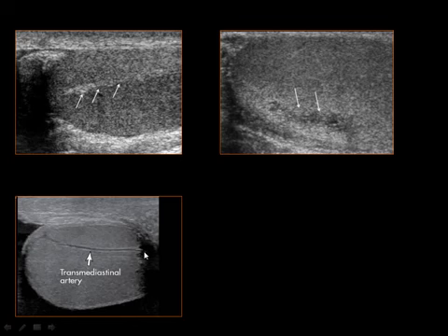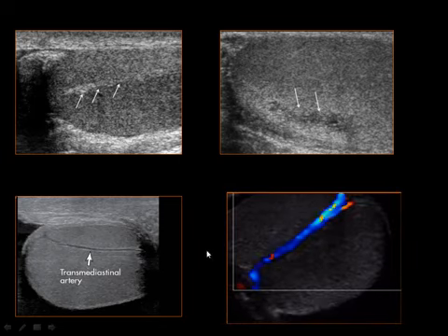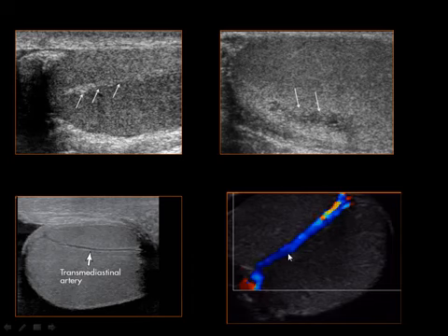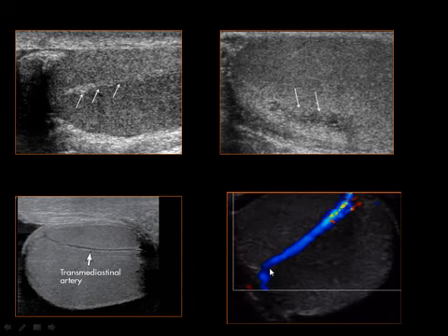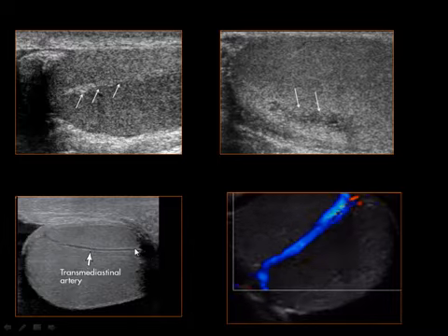This is the intratesticular band, also known as vascular cleft. It is a hypoechoic band in the middle third of the testis, nearly perpendicular to the mediastinum on sagittal scans. This band is visualized in about 10% of normal testes and measures up to 3 mm in diameter and 30 mm in length. The band is caused by a prominent artery and vein called the transmediastinal vessels.